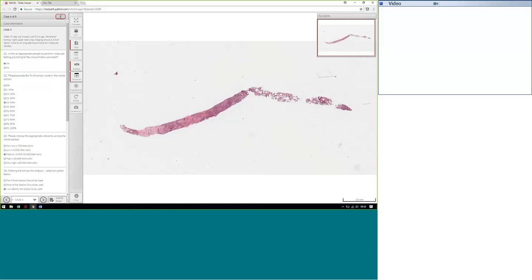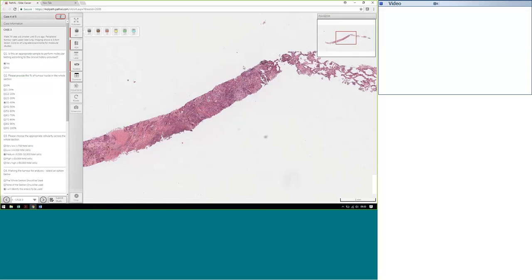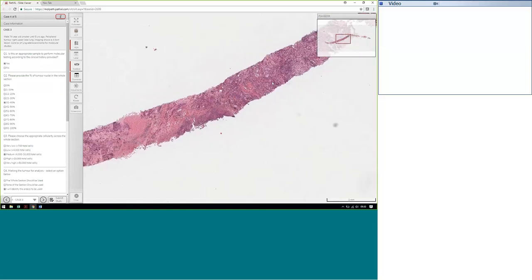This is case number 3 on the lung scheme, and it's a 74-year-old smoker, needle core biopsy with an adenocarcinoma. As you can see from the image, approximately 2/3 of this is tumour, with a third probably being normal lung. So the annotation shows the left 2/3 of the biopsy in the main, and most people agreed with all that.